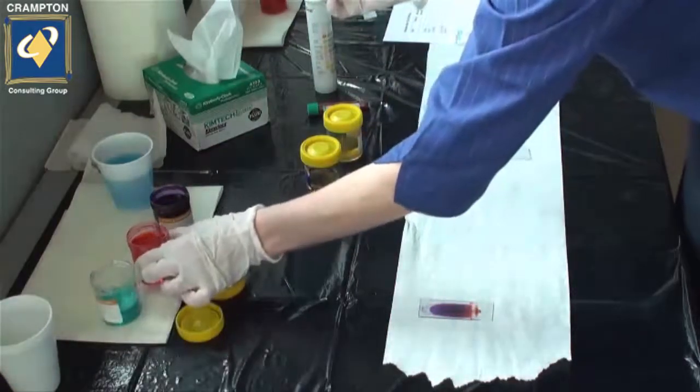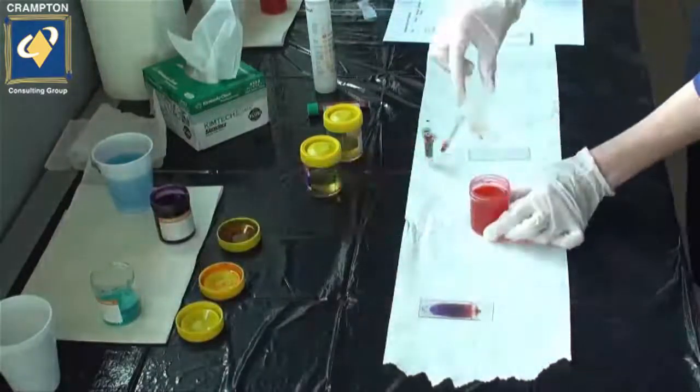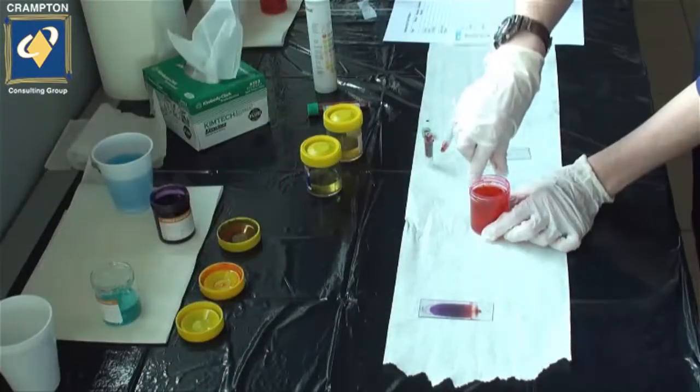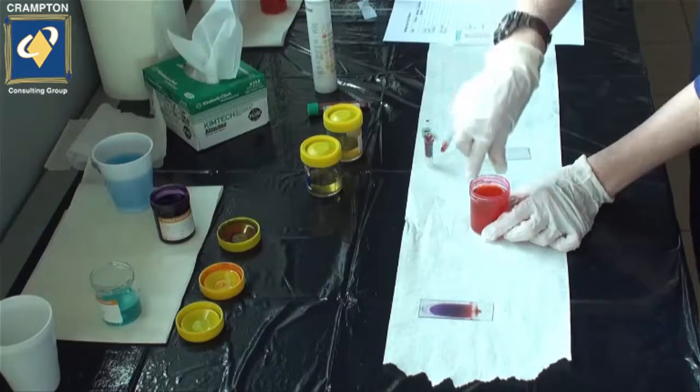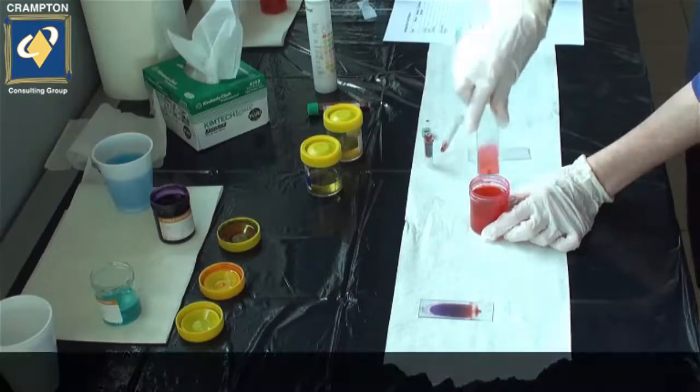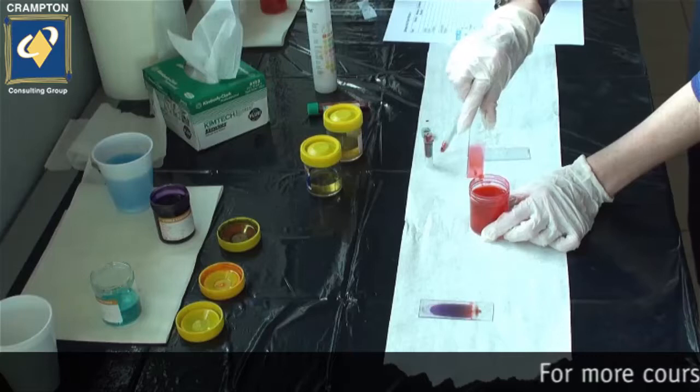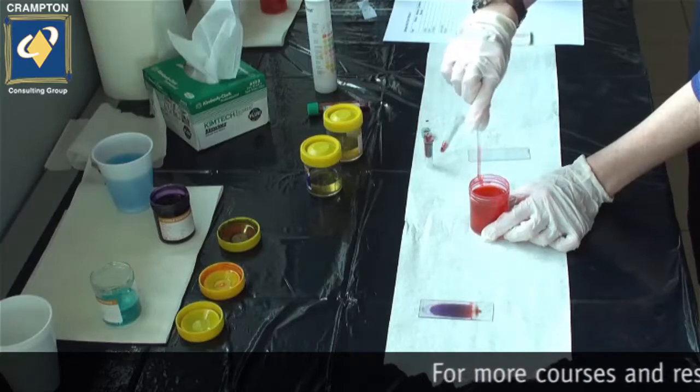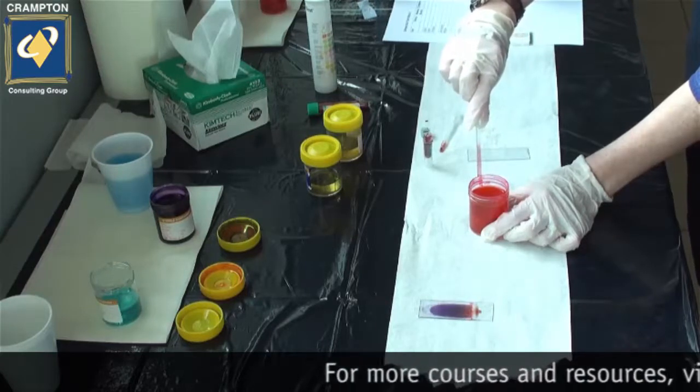Again, we go on to the second stain, which contains eosin. Certain parts of the white blood cells will take up this particular stain and help differentiate between nucleus and cytoplasm.